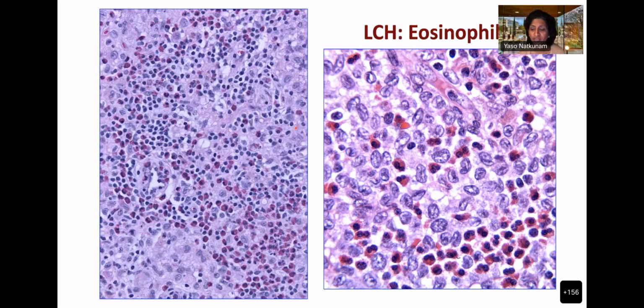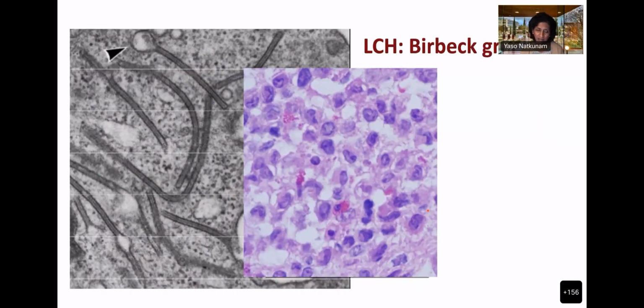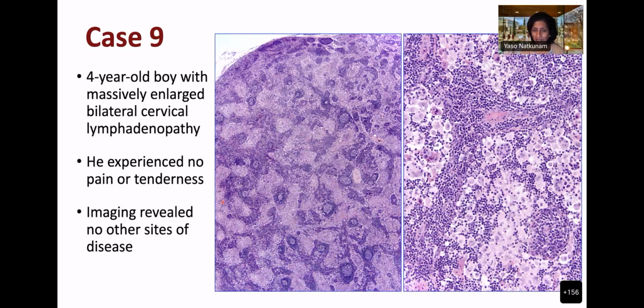Here's more pictures of it. So the eosinophilia should make you think about it. But remember the paracortical expansion, which, if it obliterated the sinus and it is a peripheral T cell lymphoma, can look exactly like this too, and you could miss these cells. And then the Birbeck granules, which EM, if anybody does that, can also show you these racket-shaped ones. For whatever reason, in the US, this is a favorite. The picture I put here is simply to show you that because it's a favorite board question. It comes up all the time, USMLE and pathology boards.